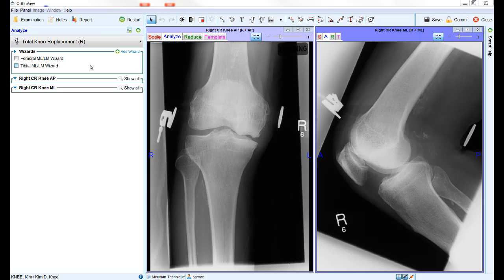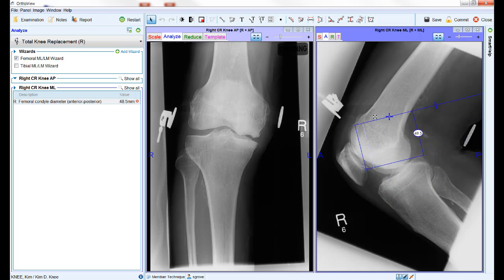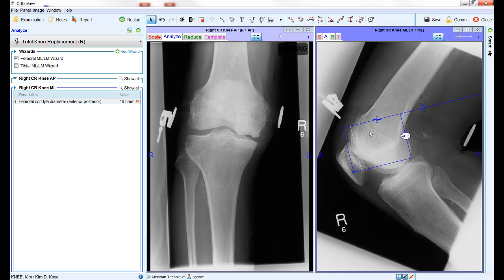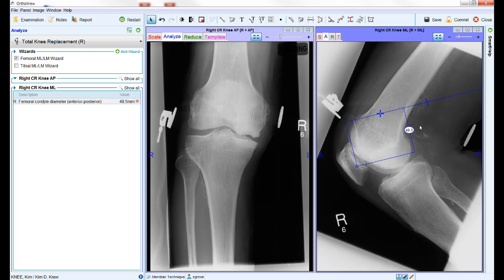Starting with the lateral view, there are two wizards available: one for the femur and one for the tibia. To use one of the wizards, tick the box to see the graphical elements of the wizard appear on the screen. To reposition the wizard, place the mouse anywhere on the general outline to move the whole wizard. Placing the mouse on a specific point allows you to move that individual point.